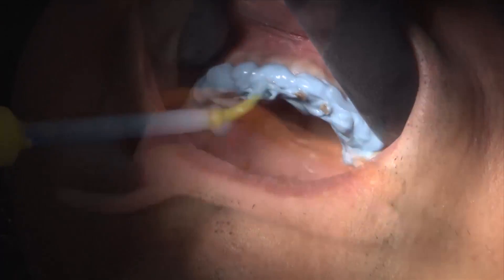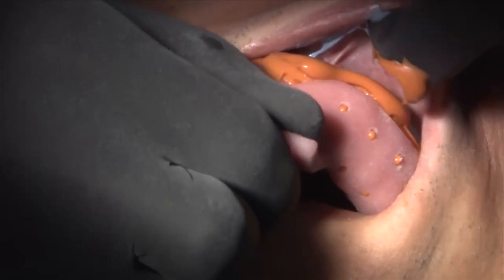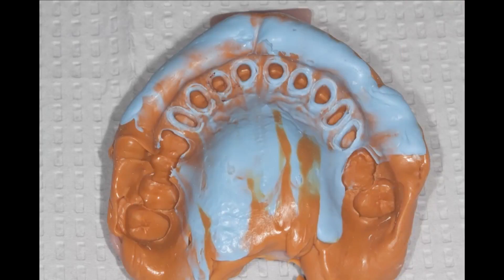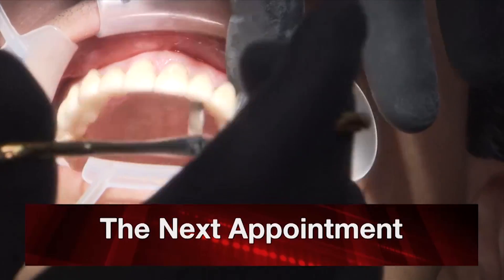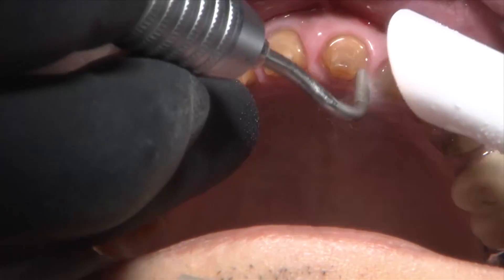Then we go through our steps of rinsing off all that, putting the light body onto the preparations while my assistant loads the tray. True to my word — a perforated custom tray for a big case like this — so we get a nice full arch impression. Again, not the same kind of retraction that we get with two cords, but enough material underneath it so that it looks really nice. About a week later we have the patient back, take the temporaries off.